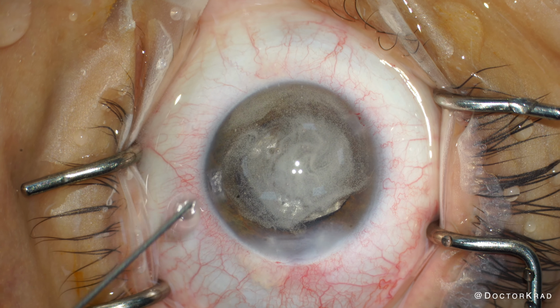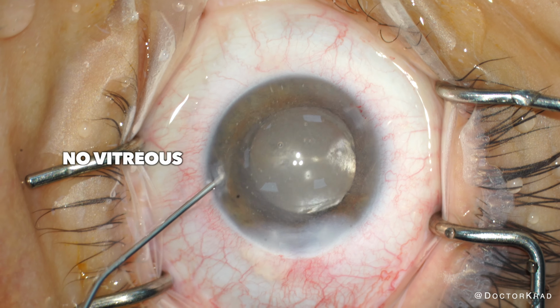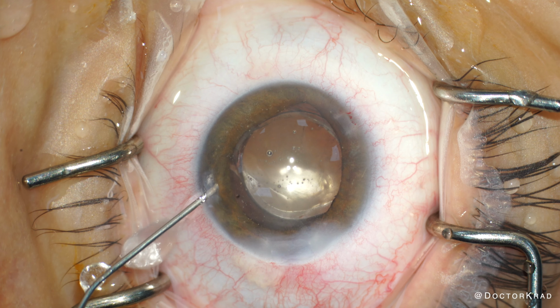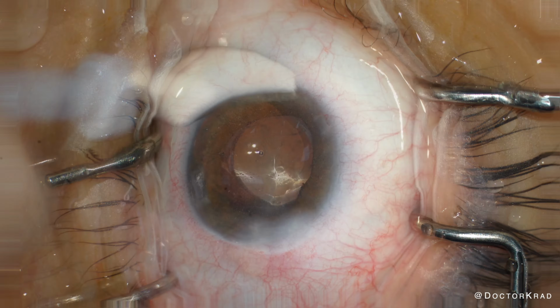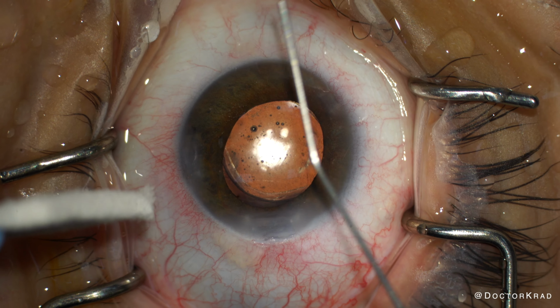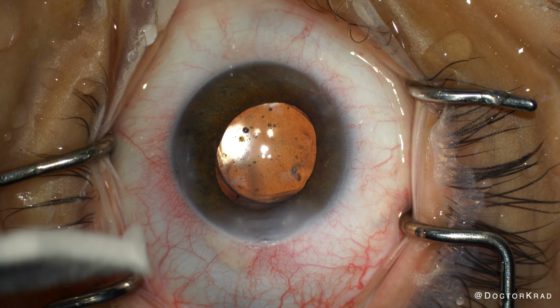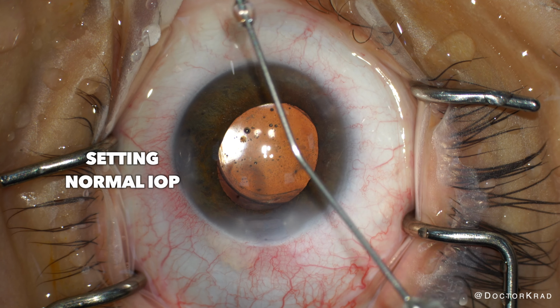So I use some dilute triamcinolone, and fortunately, no vitreous came across the zonules. I just wanted to make sure because I was using my instruments very far peripherally. Finally, I seal my incisions and make sure that the eye pressure is normal. Let's take a look at how the patient did afterwards.